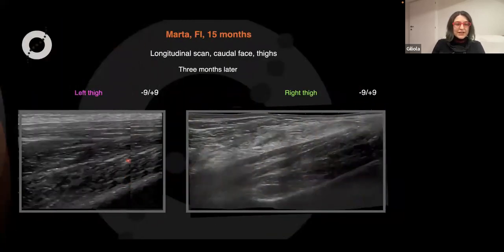And this was the comparison between the normal and the abnormal. Still not a totally normal muscle. This area, you see that it is hyperechoic, there is no scattering artifact. This is quite well defined. This is probably a little bit of atrophy and a little bit of fibrosis where the rupture was before, but it is healing quite well. And the physiotherapist is taking care that this part doesn't get fibrosis.